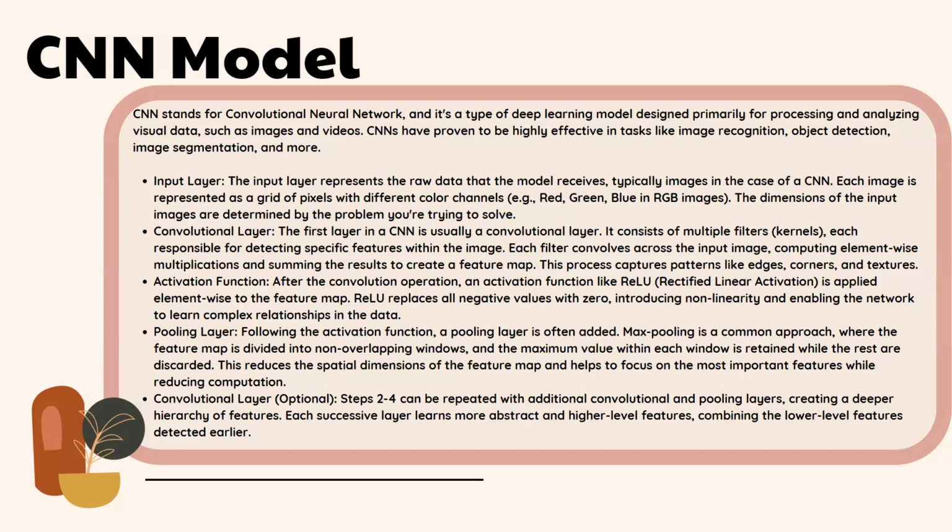The convolutional layer is followed by a pooling layer, which helps in reducing the dimensions of the hidden layer by combining the outputs of neuron clusters at the previous layer into a single neuron in the next layer. These are useful when you want to detect an object in an image regardless of its position.